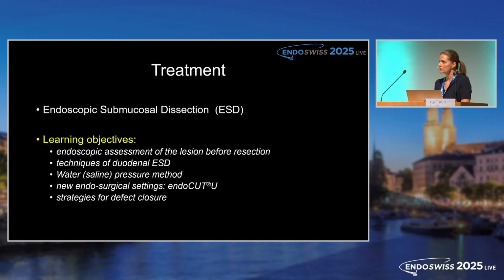The learning objectives for us are the endoscopic assessment of the lesion before the resection, the techniques of duodenal ESD, water saline pressure method, and new endosurgical settings as the technique of the underwater endoCUT, as well as strategies for defect closure.